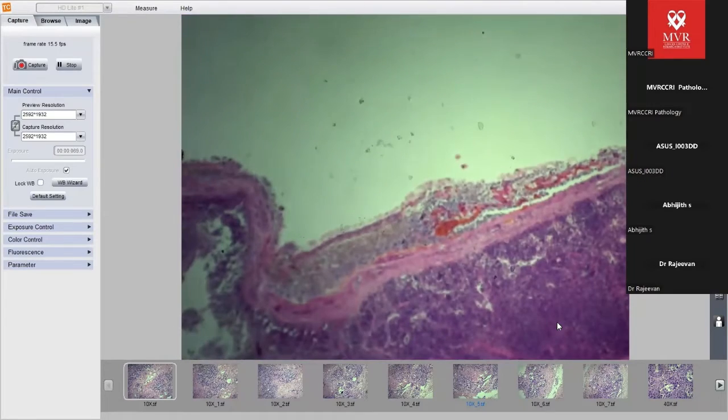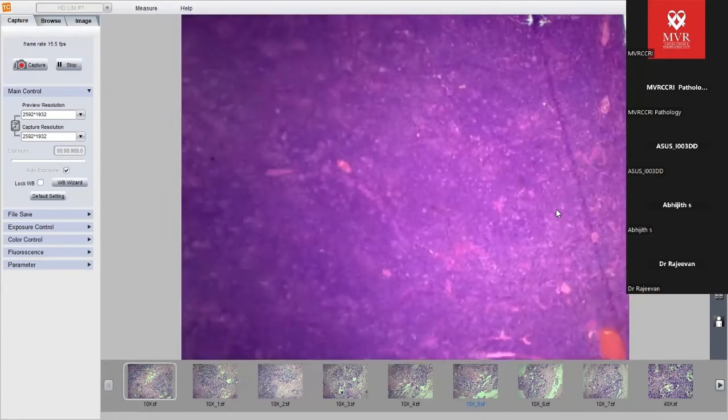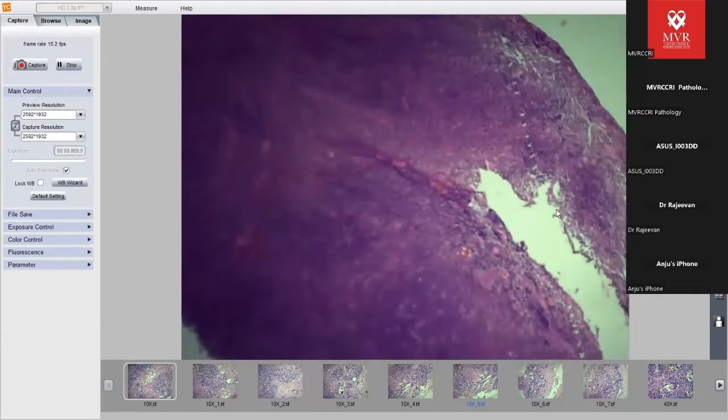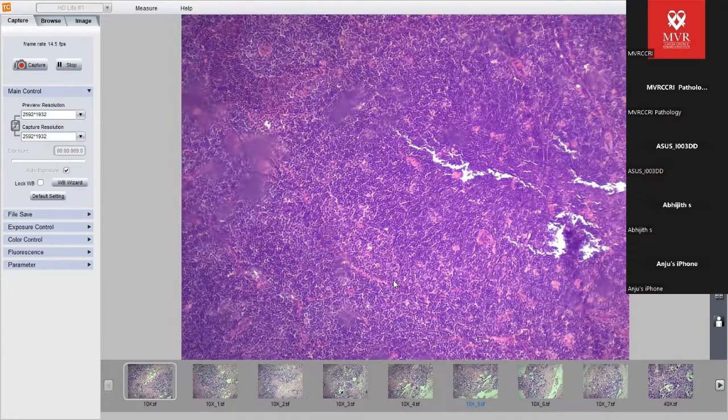Again, the capsule is thickened. Very nice thick capsule here. So we have a node. Can you appreciate the vague nodular pattern here? Vague nodular pattern. Nodules. Are there some large cells here? These cells standing out in scanner view?